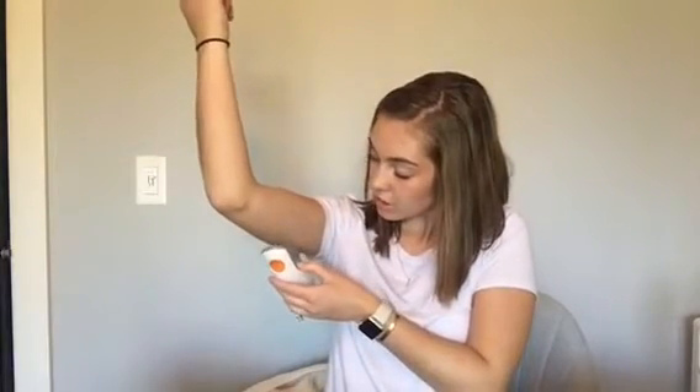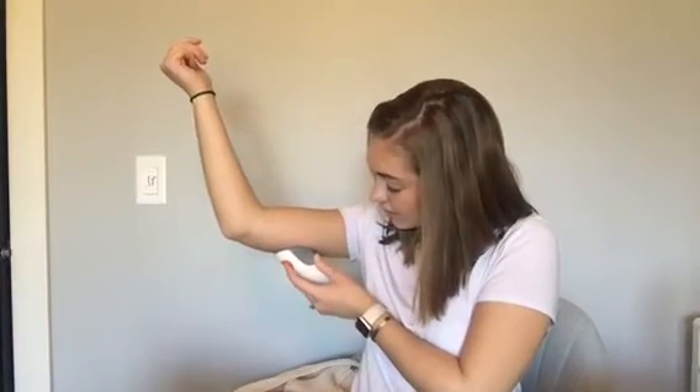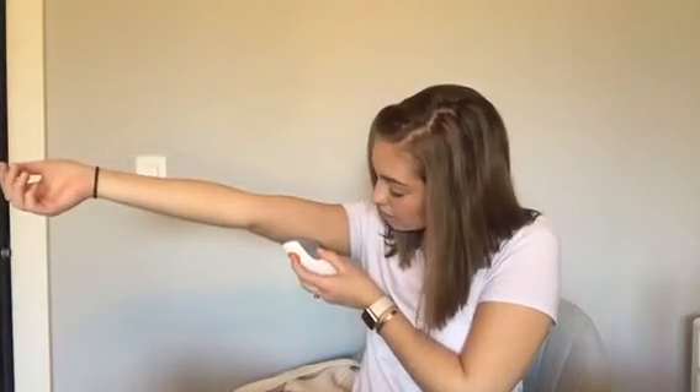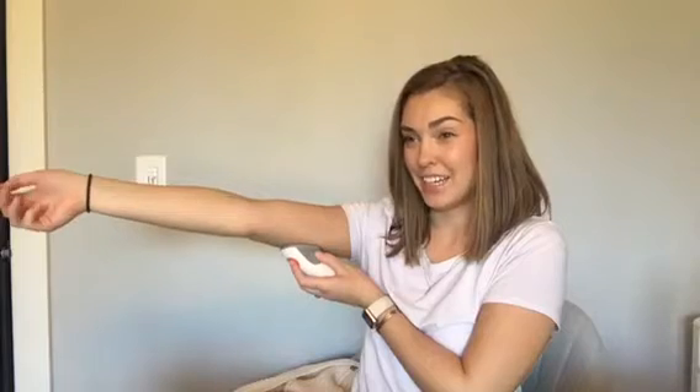I'm just going to peel — this is what the new applicator looks like, which is crazy because it's so much different than the G5. It has like a tape thing that I'm just going to peel off, and I'm going to twist that little piece. I'm just going to stick it under my arm like that, make sure it's stuck, and then just press the orange button and that should be it. We'll see.